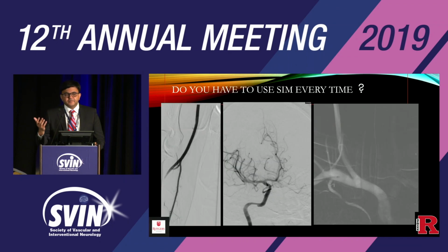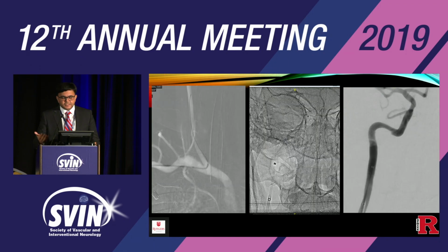Now, do you have to use SIM every time? That's where I want to get faster, because forming a SIM takes time. Sometimes it doesn't go to the descending, sometimes it goes to the ascending. So this was a patient with a dissection, who was having strokes. We did this angiogram, and we saw this is a nice angle. I don't have to use SIM. What I did was I used an Angle Bernstein. And with the wire, the wire went up easily into the external. We tracked up the Envoy, and then we dropped the pipeline. So for the right side, I actually don't even use SIM anymore. We just use an angle catheter. It goes nicely all the way into the right ICA.